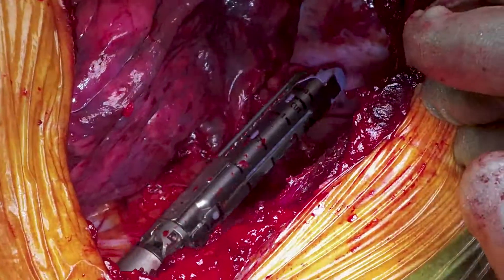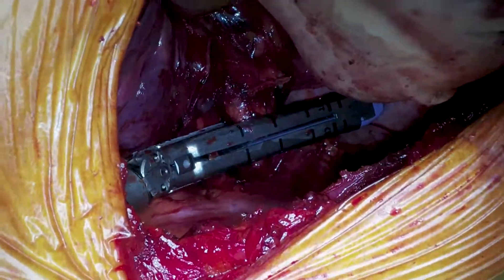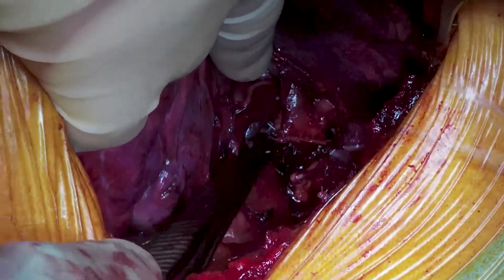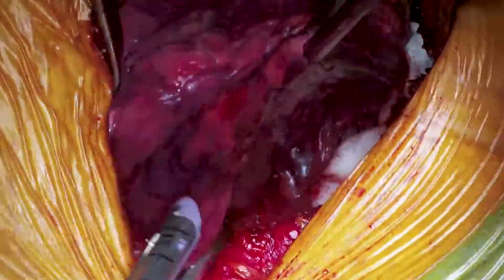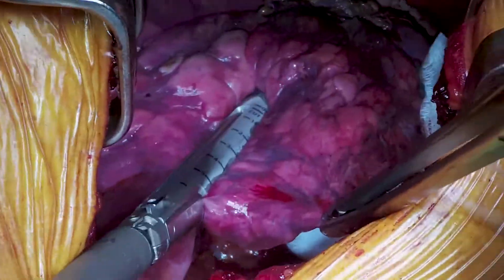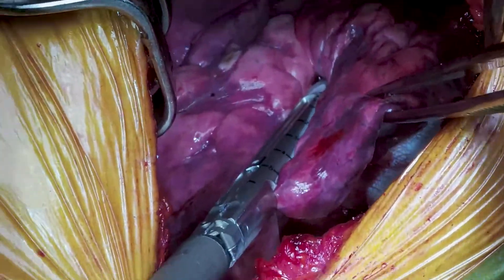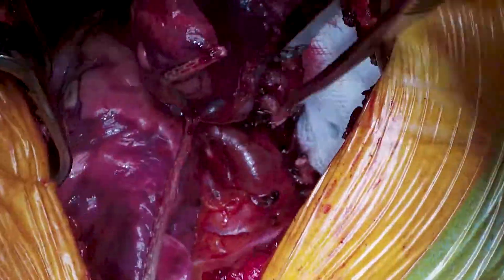We have the right upper lobe bronchus held by a right-angled retractor. The next stage is dissecting and dividing the right upper lobe bronchus — once we've done the artery, vein, and bronchus, we check for any posterior ascending branch and move on to making an incomplete middle lobe fissure. Key points: angle the stapler above the middle lobe vein so you don't accidentally cut it; know that the tumour is more posterior here so it's not in the anterior segment; ensure all lymph nodes are out, and aim the stapler toward the top of the right lower lobe to create a nice fissure.